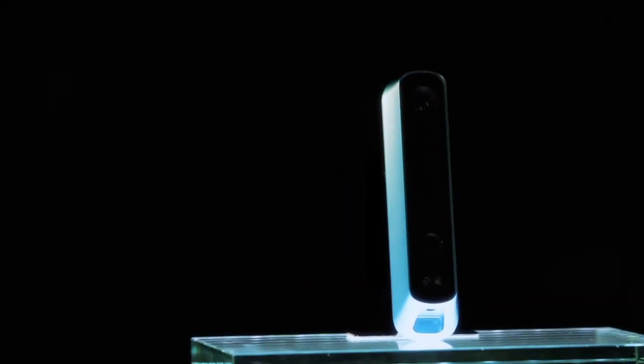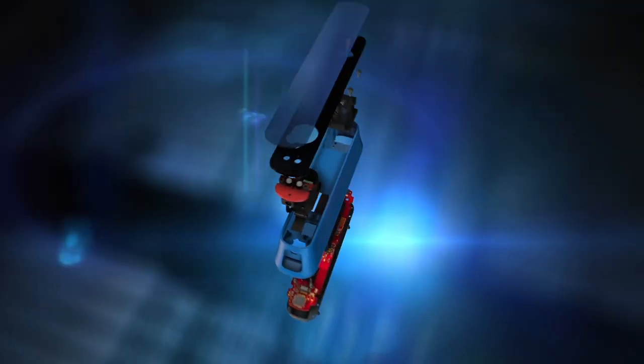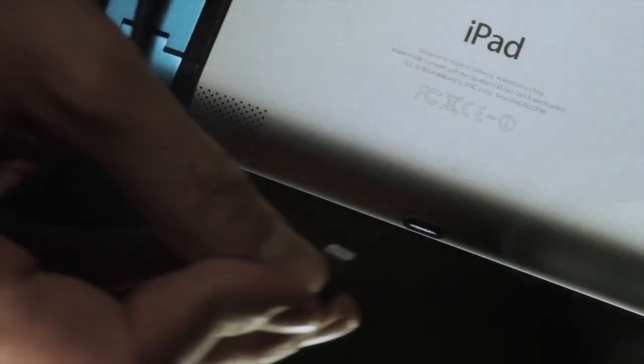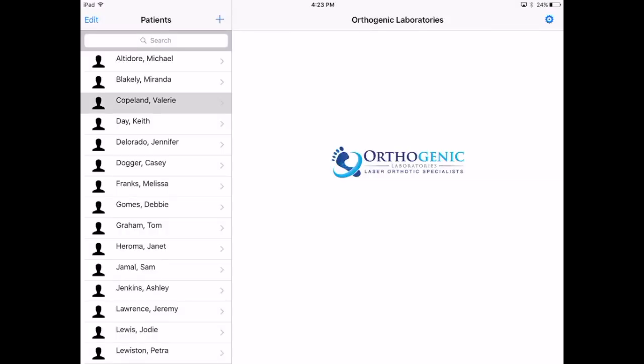Its sleek, single-piece body is machined from high-grade anodized aluminum and serves as both a beautiful exterior as well as a thermal core that keeps the precision optics inside at an optimal temperature. The scanner latches securely to your iPad and connects via the lightning port without the need for any additional equipment or cords.